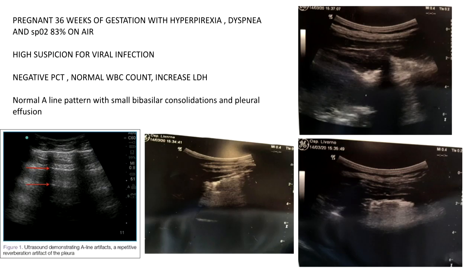I will show you how lung ultrasound can be of interest to do a differential diagnosis.